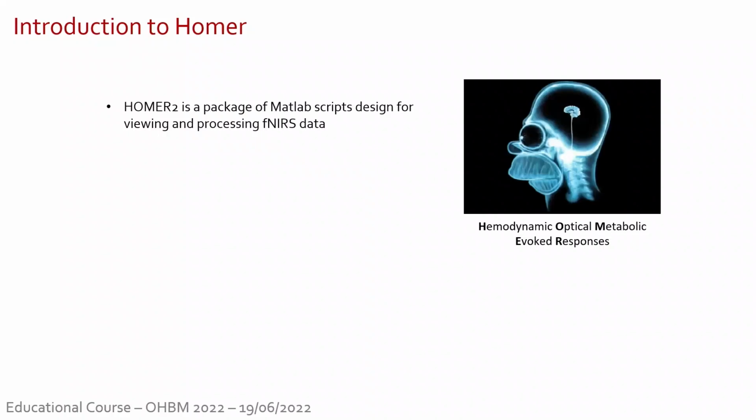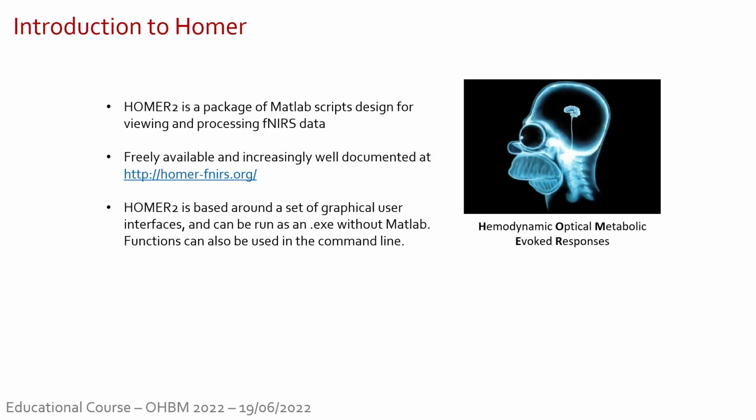So just a little bit more on Homer, because this is the one that is, I guess, mostly used. And if you are a new NIRS user, you might want to start looking at your data with that. As I said, it's MATLAB script based, and it's freely available and well documented.